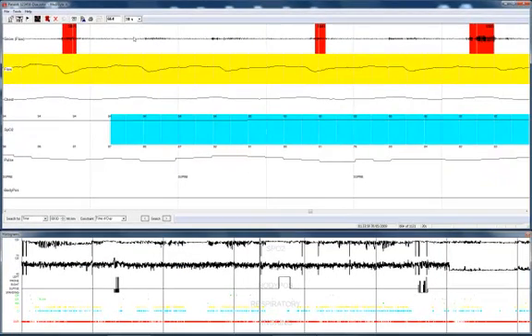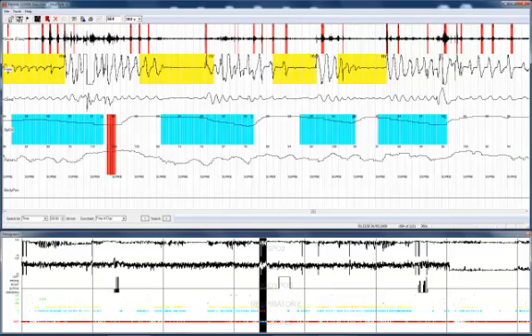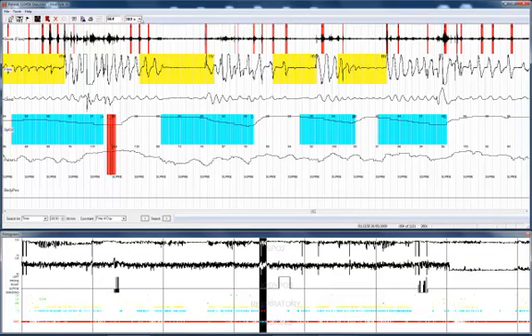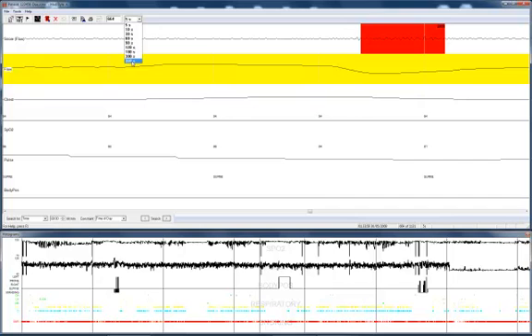For respiratory events, one will look at a display width between 90 seconds and 360 seconds.